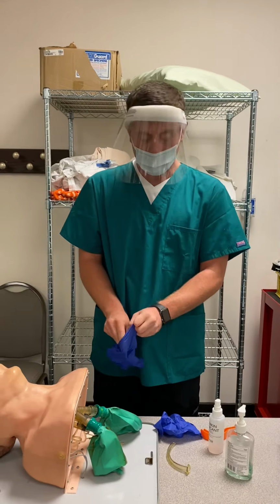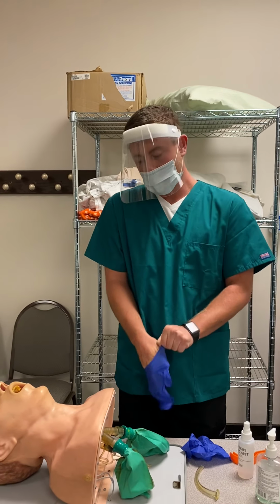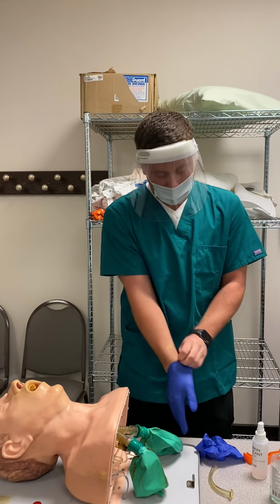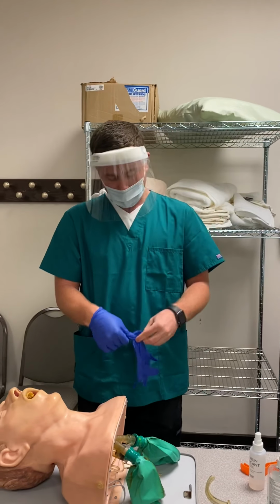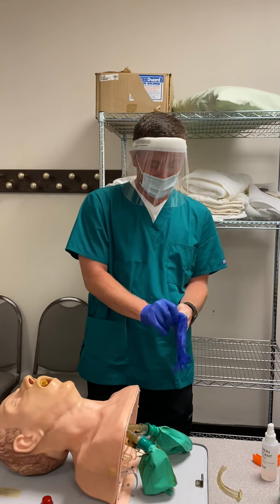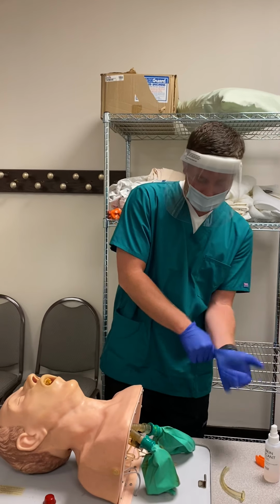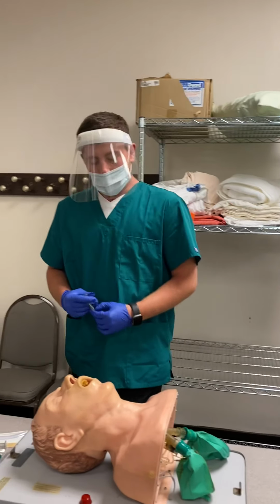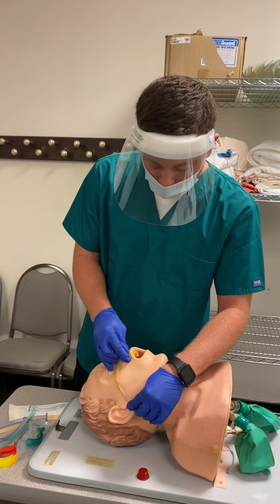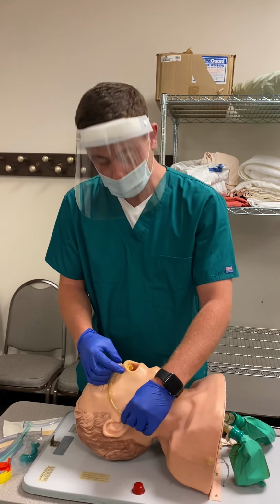And with that, the nasopharyngeal airway can be inserted on a conscious patient, and that is why you verify their name and date of birth. And when measuring for the nasopharyngeal airway, you'll line it up at the corner of the nose and bring it to the earlobe, allowing the flange to stick out.